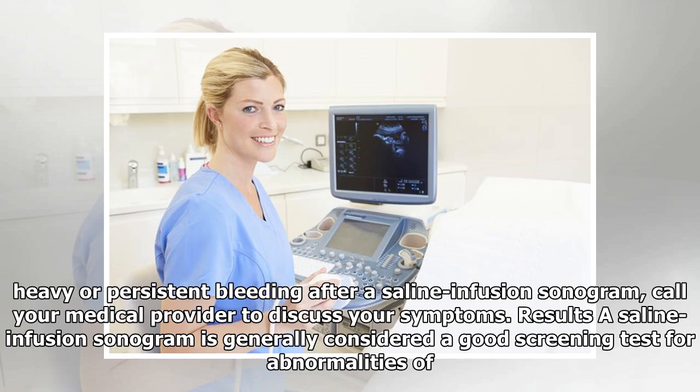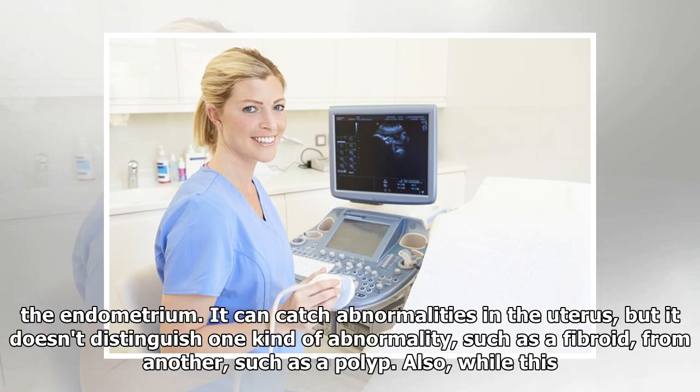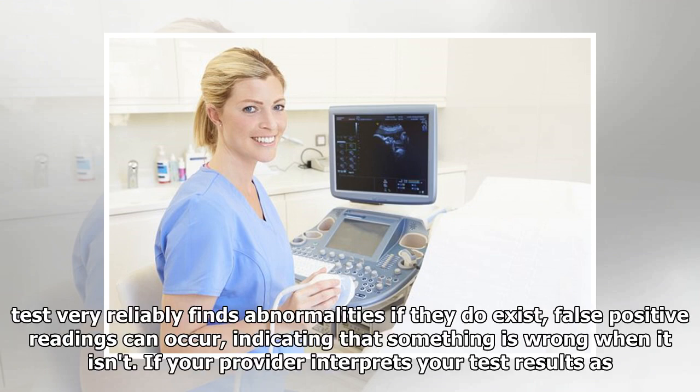A saline infusion sonogram is generally considered a good screening test for abnormalities of the endometrium. It can catch abnormalities in the uterus, but it doesn't distinguish one kind of abnormality, such as a fibroid, from another, such as a polyp. Also, while this test very reliably finds abnormalities if they do exist, false positive readings can occur, indicating that something is wrong when it isn't.